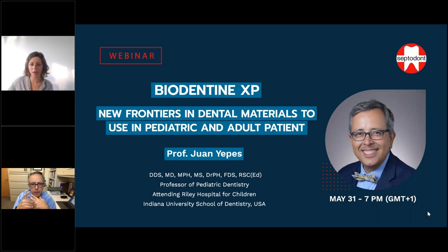Is it possible to apply Biodentine and Biodentine XP as a bulk material? As a what, Aurelie? I'm sorry? As a bulk material. As a permanent material. I cannot hear you. As a bulk material, I mean, for example, if the pulp is exposed, from the pulp to the top of the cavity. Yes, you can do that, of course. Yes, absolutely. Yes, you can do that.